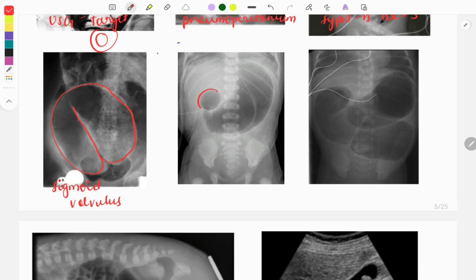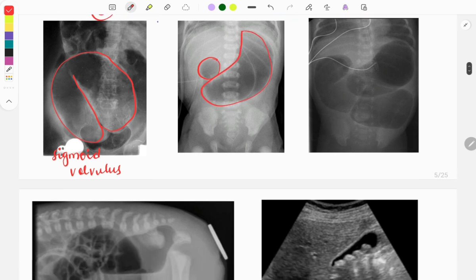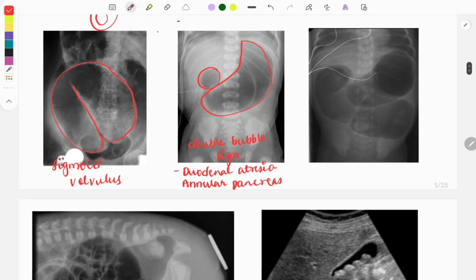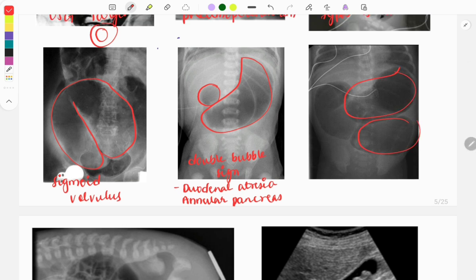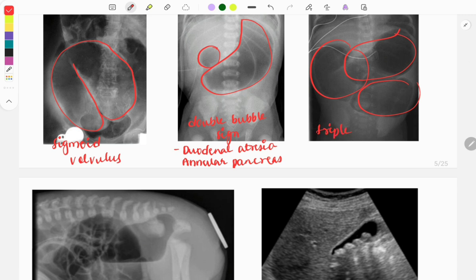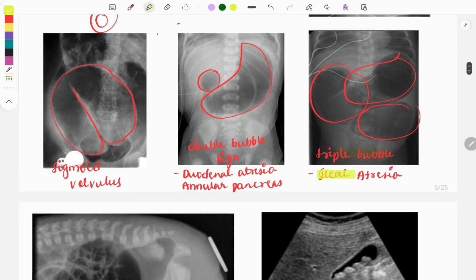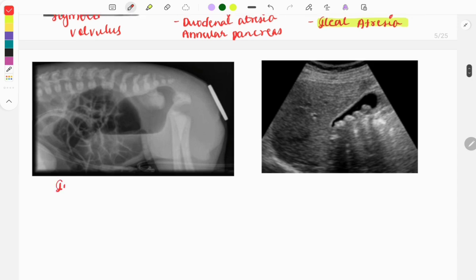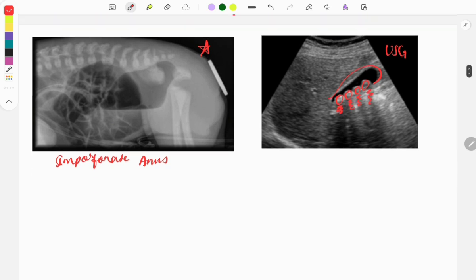The double bubble sign — two bubbles — is seen in two conditions: duodenal atresia and annular pancreas. The triple bubble sign — three bubbles — is seen in jejunal atresia. The next image is used to look for imperforate anus. On ultrasound you can see multiple gallstones in the gallbladder with posterior acoustic shadowing, an image of cholelithiasis.